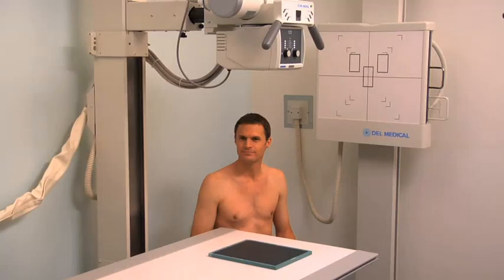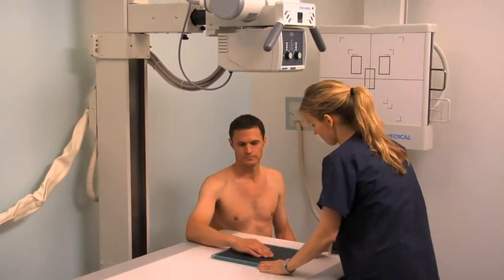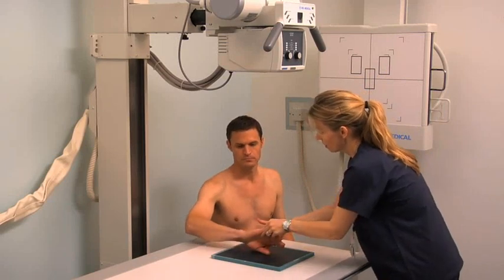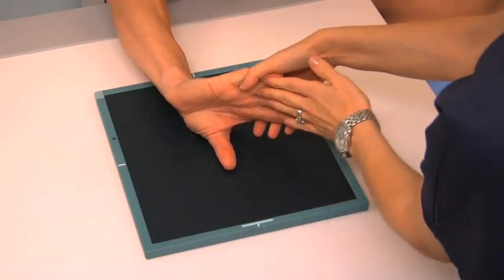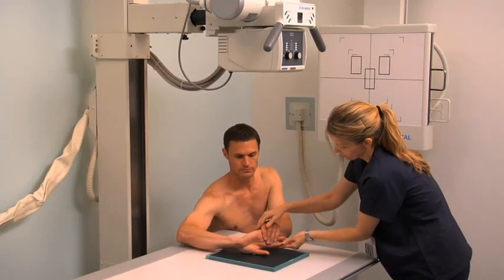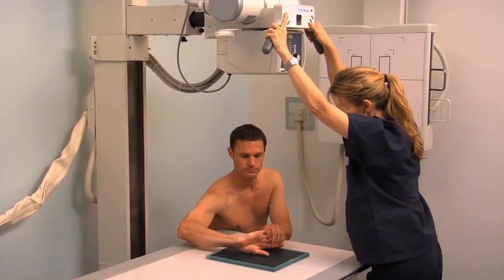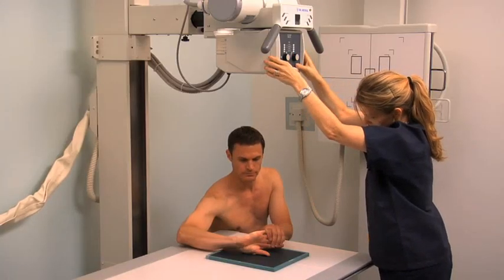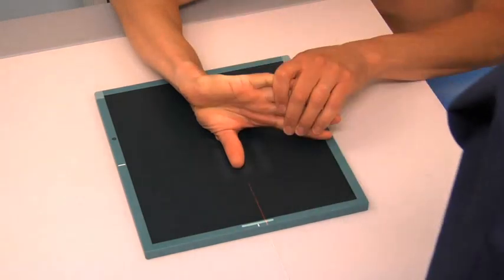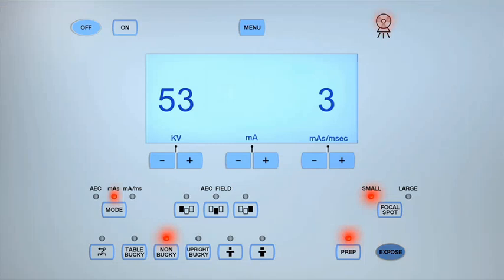To obtain a radiographic projection of the thumb in the AP projection, begin by asking the patient to place their hand palm down on an 8-by-10-inch cassette. Rotate their hand and forearm medially until the posterior aspect of the thumb and the first metacarpal are centered to and in contact with the cassette. Extend their fingers and ask the patient to hold the fingers away from the palm using the other hand. Center the central ray to the first MCP joint. Collimate the light field to include the distal and proximal phalanges, the first metacarpal, and the first MCP joint, then expose the cassette.